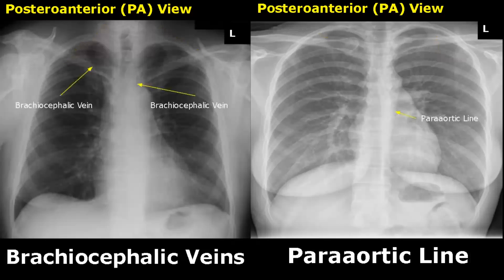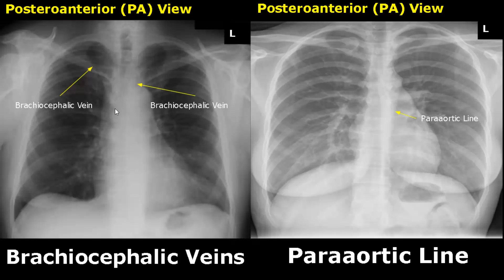Here are the brachiocephalic veins. The left brachiocephalic vein has a longer course because it goes from left to right to drain into the superior vena cava. The right brachiocephalic vein is shorter and has a more lateral course.